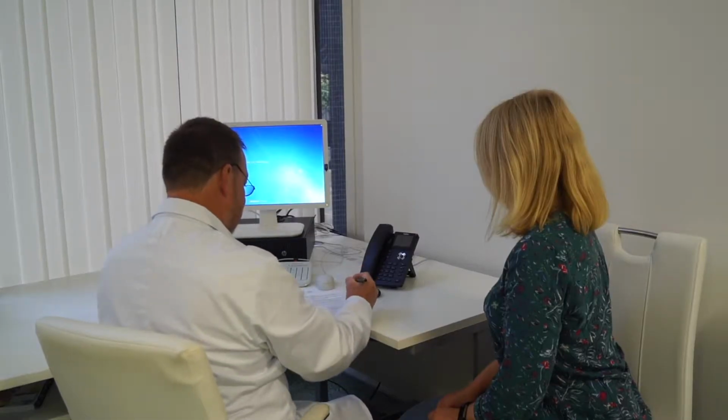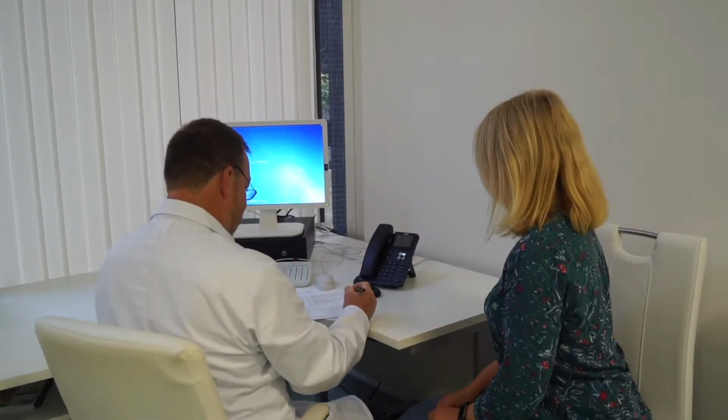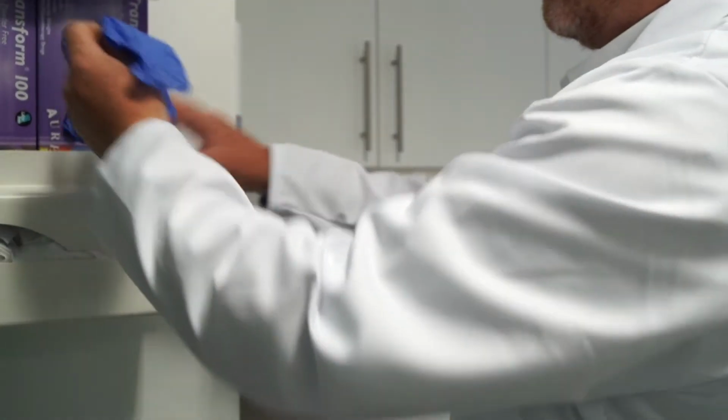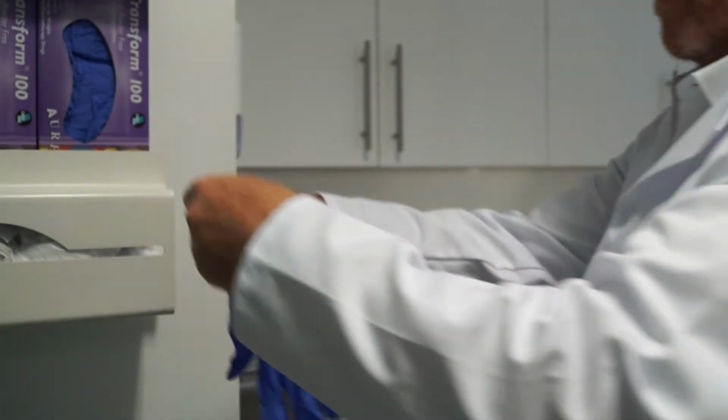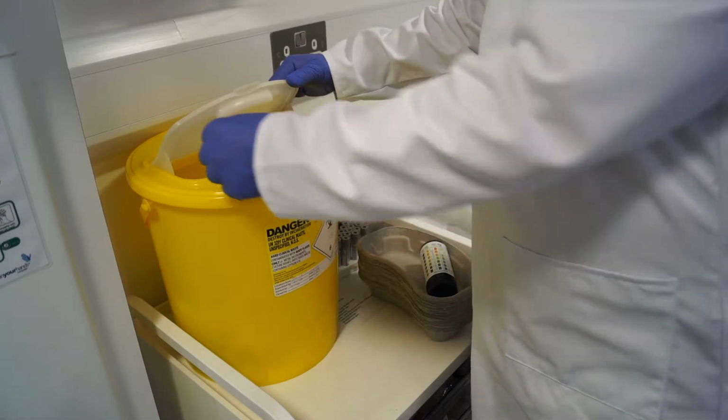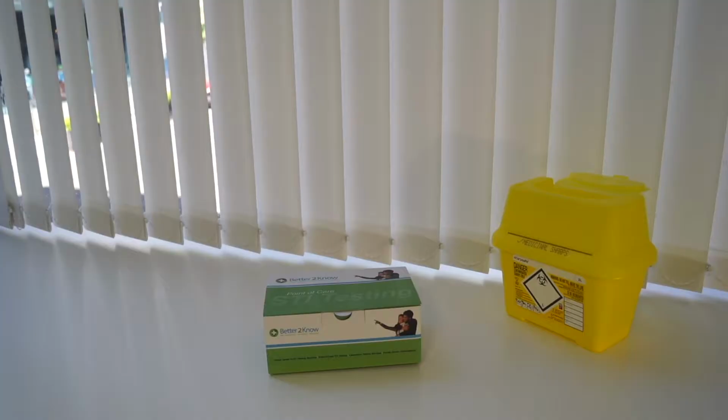There are a number of safety procedures to be followed in order to ensure the test can be carried out. These include storing the kit safely within a temperature of 2 to 30 degrees Celsius, not using the kit if it is not sealed, has been punctured, or has been tampered with, preparing a clean and clear area on which to run the tests, wearing suitable examination gloves and clothing, disposing of all materials in a suitable biohazard waste container, and treating all biological samples as potentially infectious.